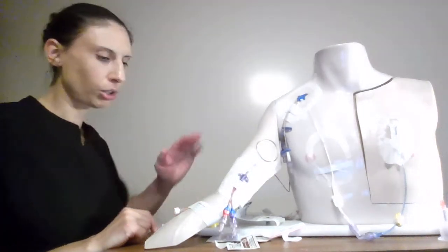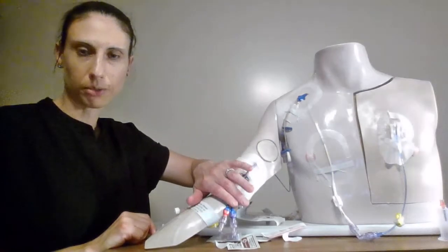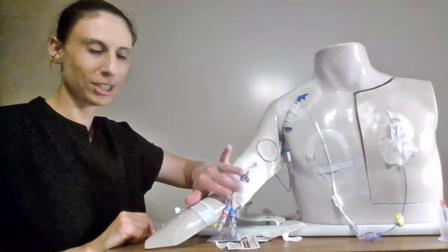Hi everyone! So this skill is going to go over a cap change and blood work from a PICC, a peripherally inserted central catheter.